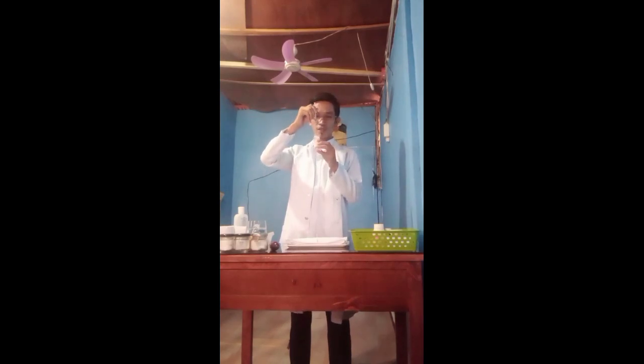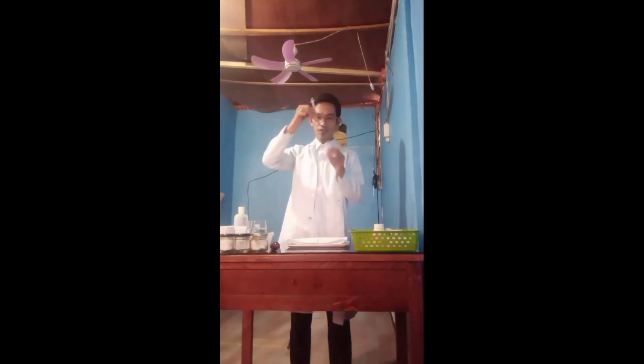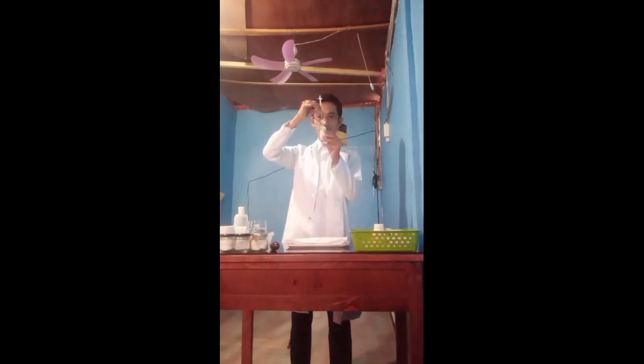So I have here. When injecting, just hold the syringe by forming the dart position, just like this. So straight. Okay. So it's already intact.